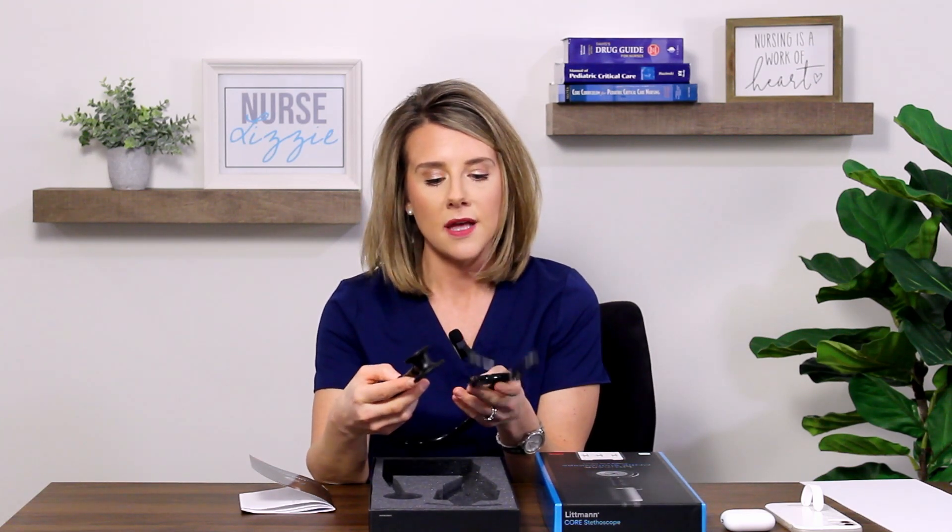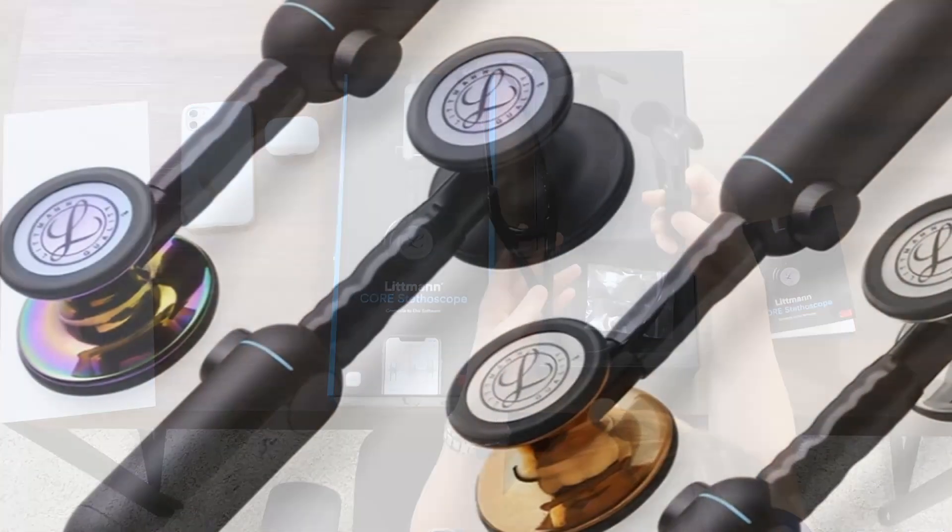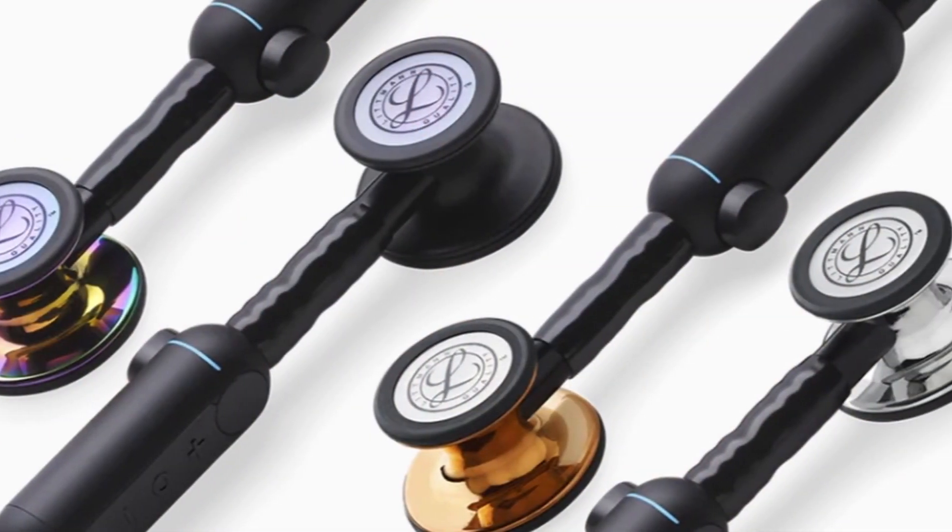I feel elevated just wearing this around my neck and I haven't even done anything to listen with the stethoscope. I was looking on the website and there are some really cool features. There are four different styles and finishes you can get — I have the all black finish here, but you can also get a rainbow finish, a copper finish, and a mirrored finish.